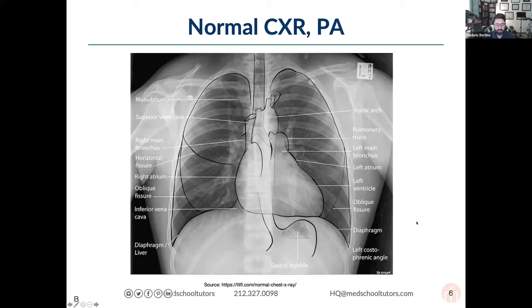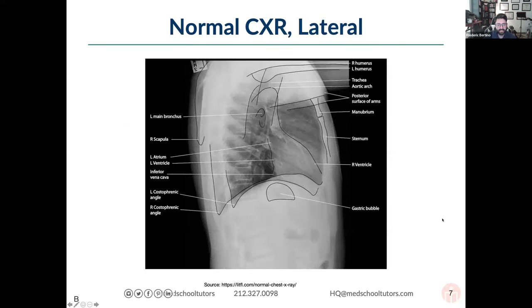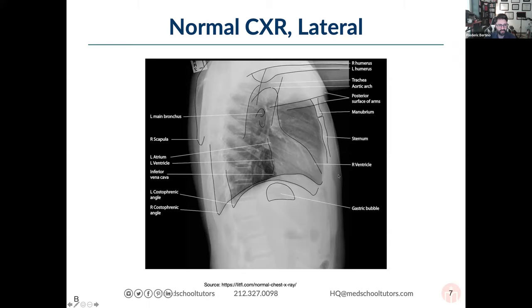Here's our lateral view showing what the chest looks like from the side. The spine is oriented toward the back, so the heart projects over the front. You've got the sternum outlined here. The little circle in the middle of the chest radiograph is the left main bronchus, which goes out a bit straighter so you can see it on end. Superimposition of upper extremities can make it difficult to see upper lobes on the lateral.